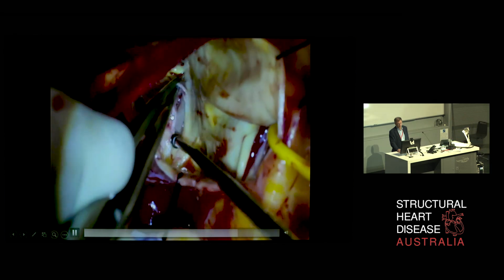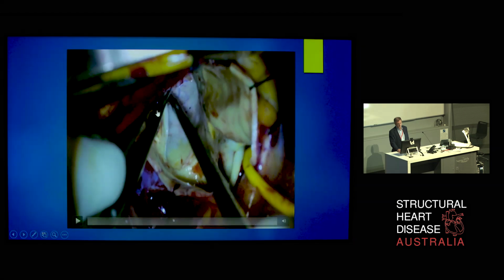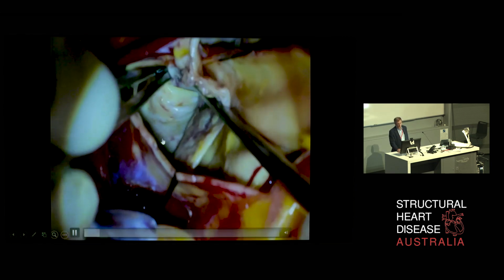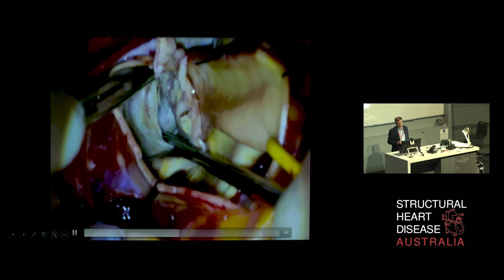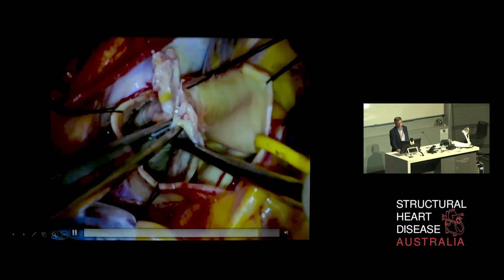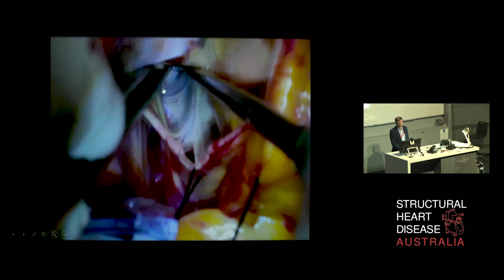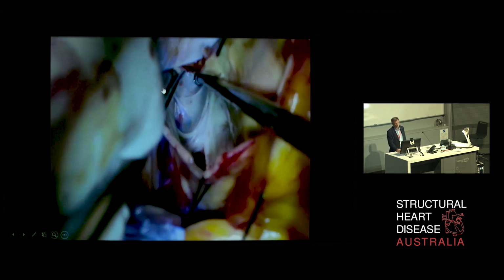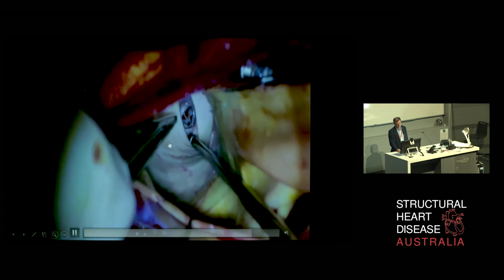And then this is all this thromboembolic disease. This is very chronic, lots of calcium and atherosclerotic disease. And you have to chase it out into the segmental and subsegmental branches. There's a fibrous tail there going out into a subsegmental branch. You've got to separate all that and remove the specimen. And then when you've removed it all, you've got to check every segmental and subsegmental orifice to make sure you've got everything out. That's a pretty good clearance there.